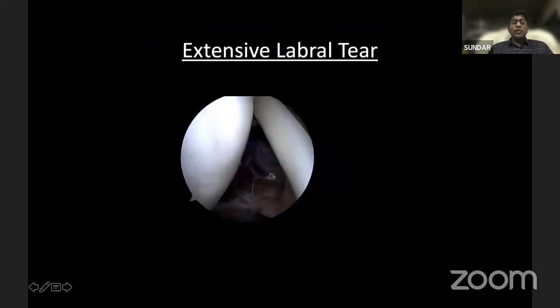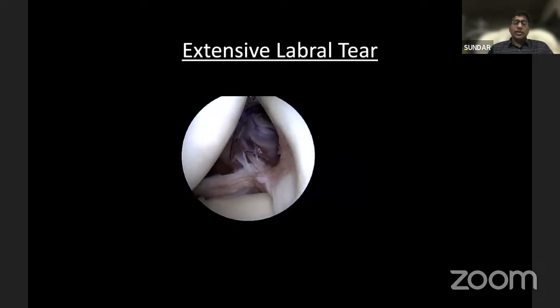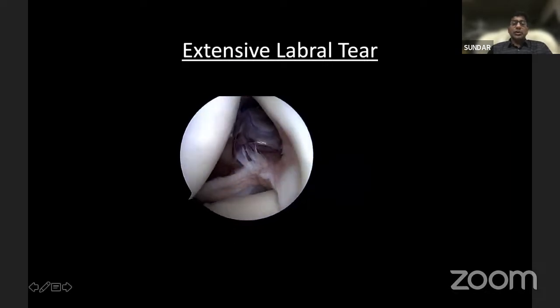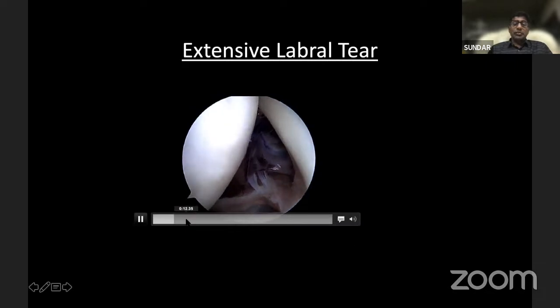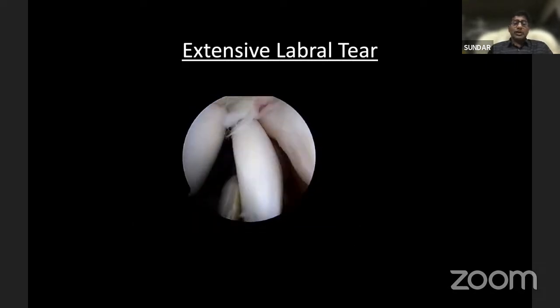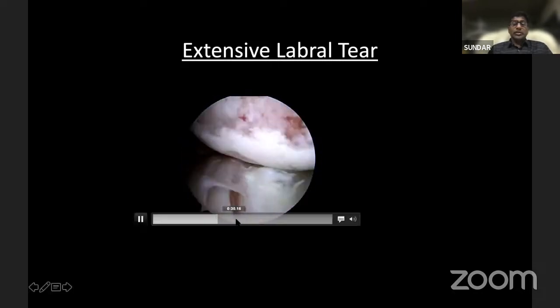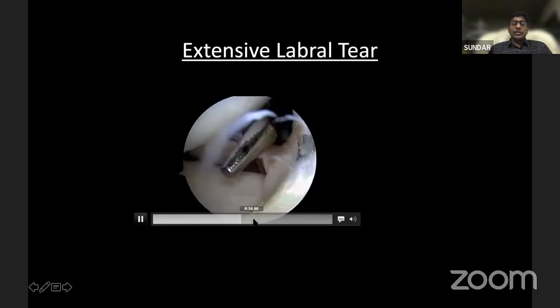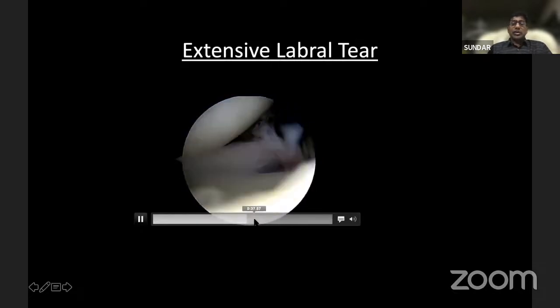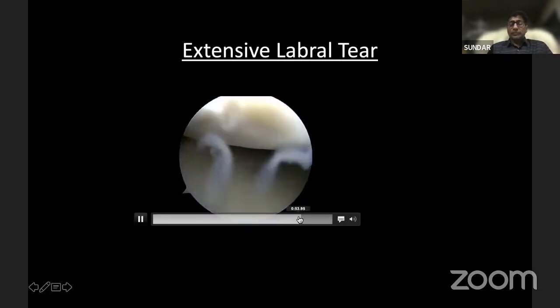Once you have made all three portals, then you assess again, still assessing from the posterior portal. Don't miss the SLAP lesion, because sometimes MRI cannot pick up the SLAP lesion. If you don't address the SLAP, when doing the anterior Bankart repair, the chance of failure is a bit high. You can see this patient had an extensive Hill-Sachs. You assess the SLAP, you can see this patient also had a SLAP lesion, and also this patient had an anterior labral tear.